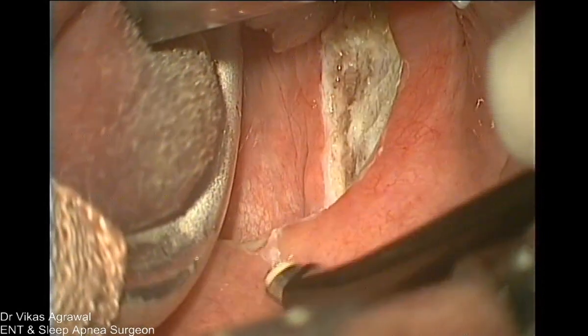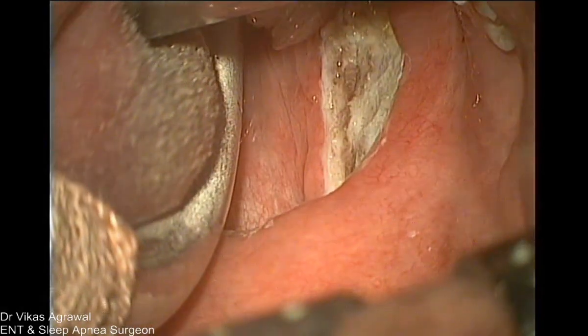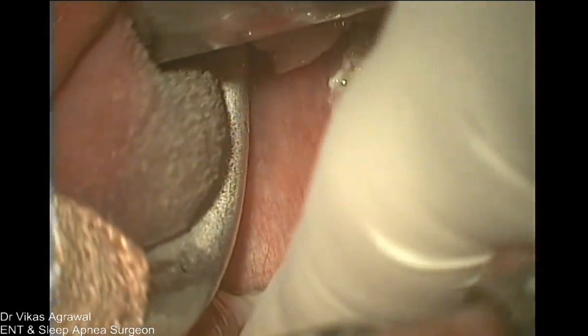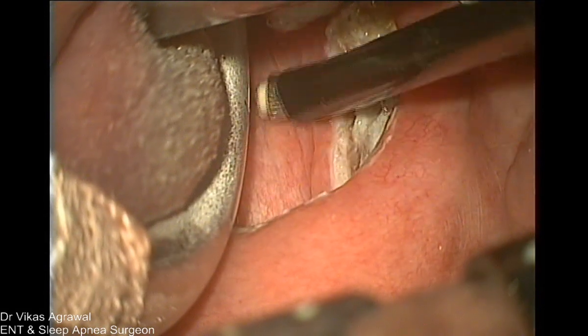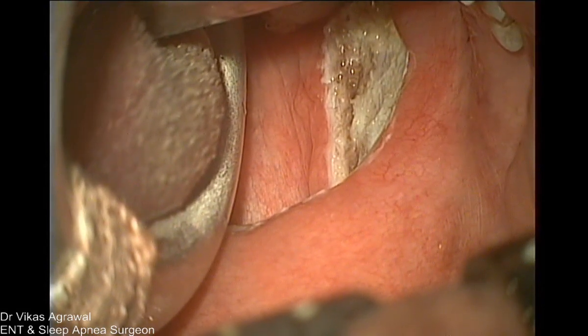Now we know that we have not done anything to this palate, so this palate is absolutely soft. So the movement and the length of this palate is sufficient, right? It is going and touching. Absolutely. So we have underdone, we have not overdone. Yeah, that's very important. So see, essentially you can always revise it. You should not overdo the things. Right.